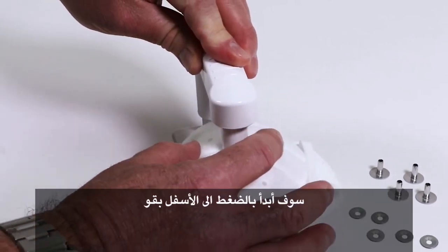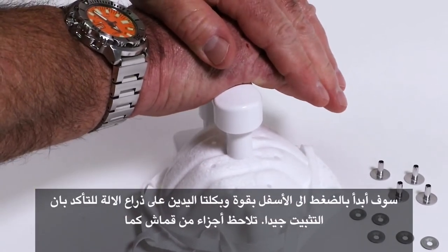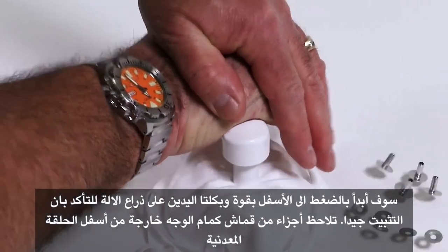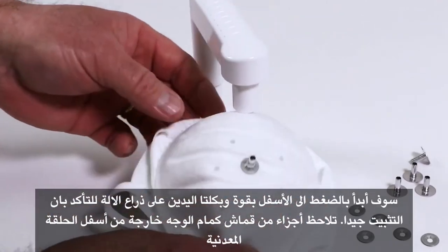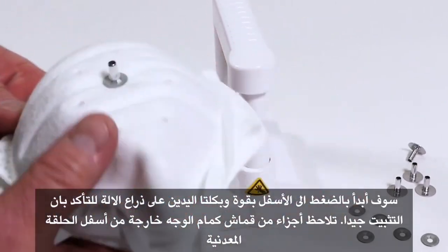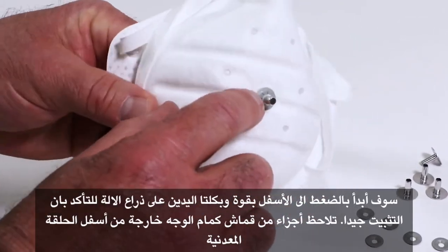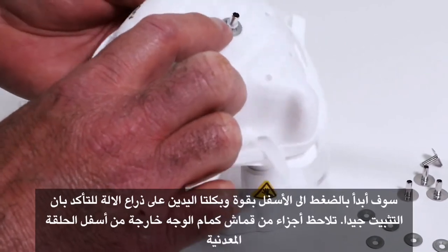I'm now going to engage and I'm going to use both hands and push firmly down onto the probe, engaging that probe with both hands to make sure that I get a good probe insertion. You should see a little bit of material from the filtering facepiece coming up through the push nut.